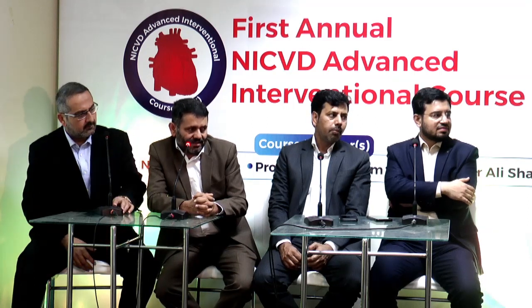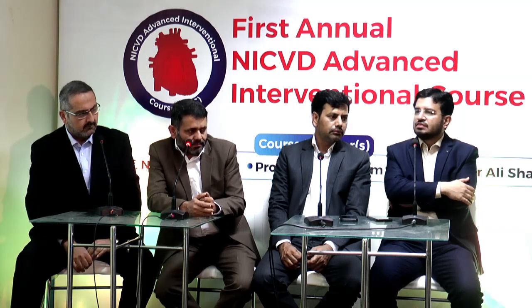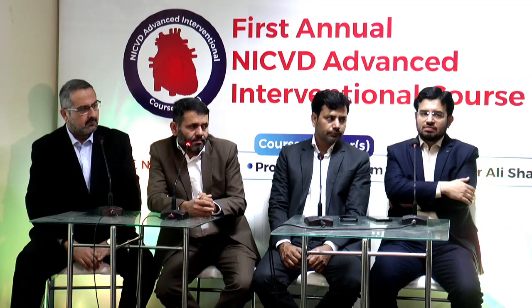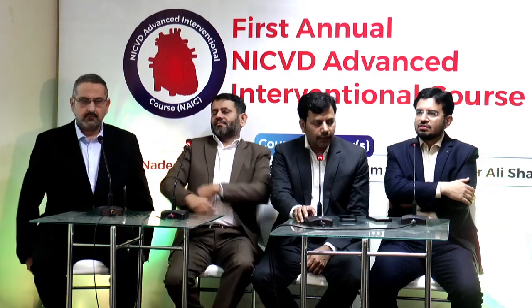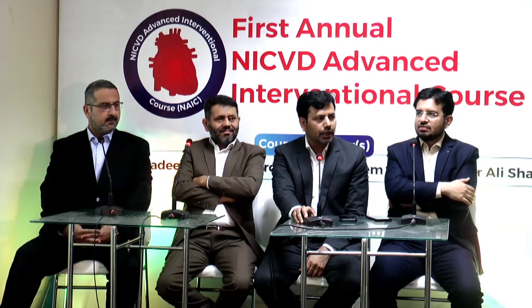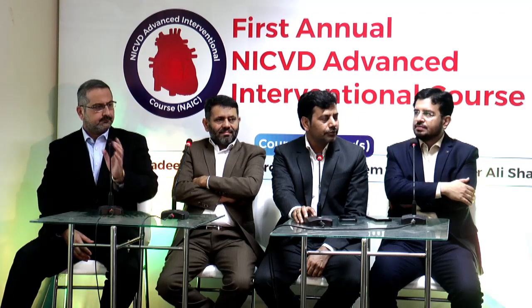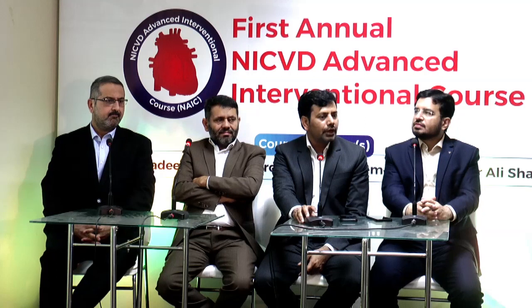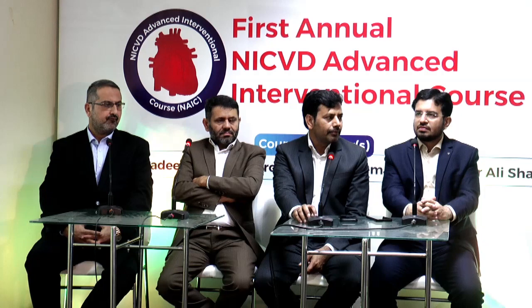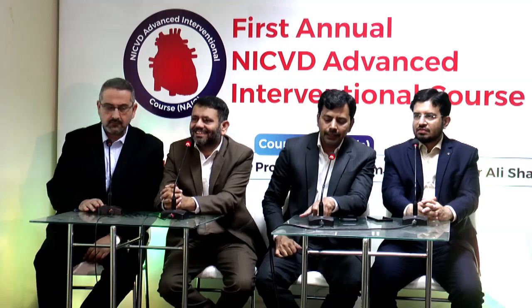So you would use the IABP for circulatory LV support, to unload the LV? Yes, in case it were to go down, and not to augment coronary flow. His LV is normal, I think. But considering the scenario, if this patient came in cardiogenic shock with ST elevation MI, even with the culprit artery being the SVG to LAD, what would be the strategy? Patient is in shock. In acute MI with cardiogenic shock, that is another scenario, because of the acute occlusion of the vessel.